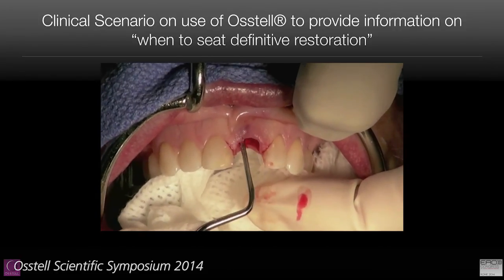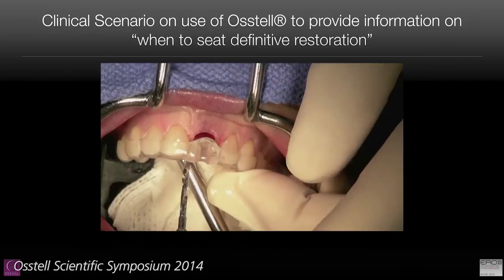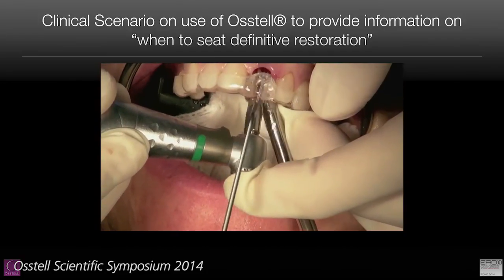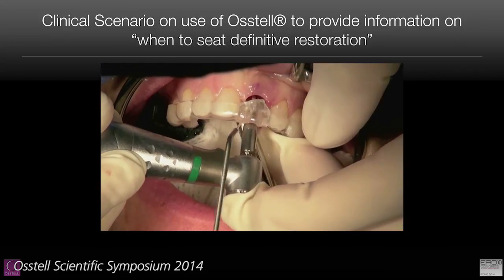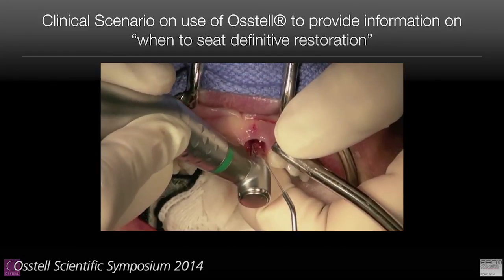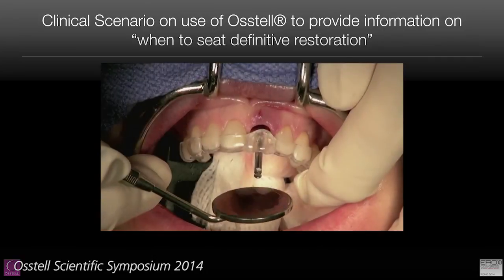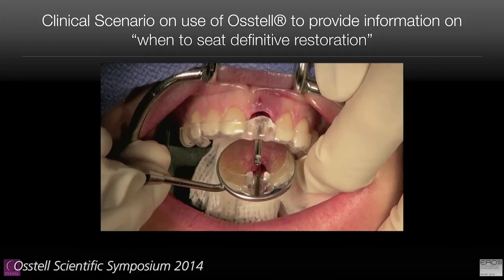Sometimes it's possible, sometimes it's not. For me to immediately place the implant, I must maintain that solid bone that we find on the palatal aspect of the socket. It doesn't matter what happens on the labial aspect as far as implant stability is concerned. It does matter as far as soft tissue. But for me, primary stability is the key, and this is how I determine that.